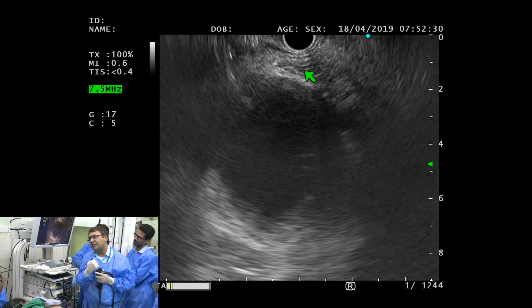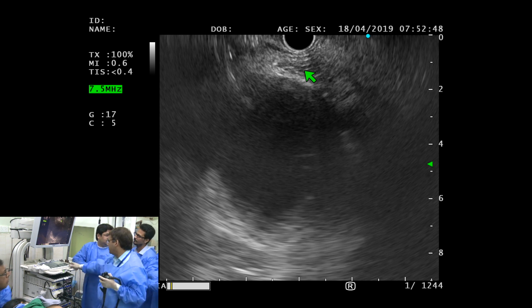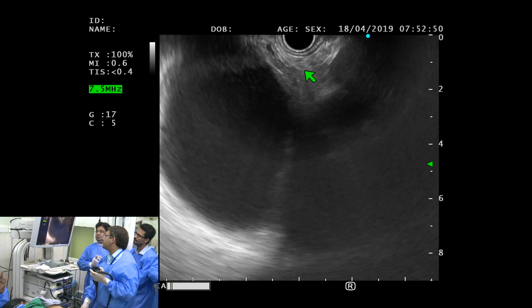Let's focus on that, and then what I would like you to do is keep your questions, and we'll answer all those later. Khalid, sorry. No, that's okay. I think we should, the patient is sedated. We should finish the case and let me explain everything, and we can answer all the questions later. Okay.